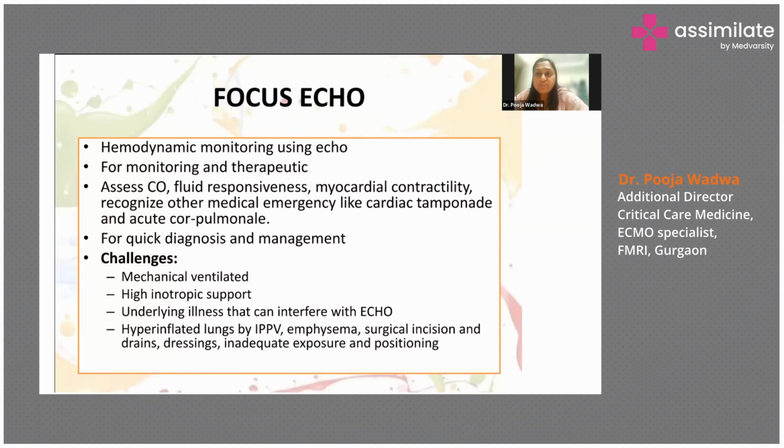Now his blood pressure is low. Looking at him you are not able to decide whether to give him fluid or not. So here hemodynamic monitoring is important. You need to assess whether he requires fluids or not, and here you can make use of echo.